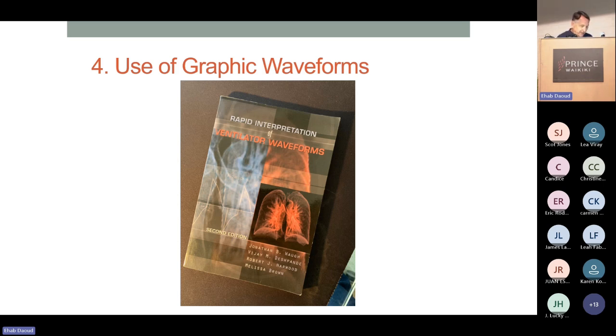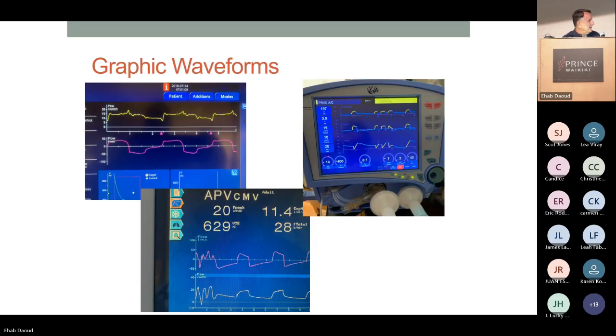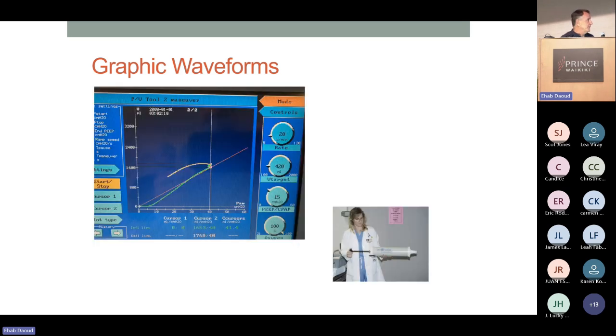So you can find a variety of things just by looking at the patient's waveforms. This is an older ventilator we have in one of our hospitals where we have a consistent problem with this kind of flow waveform that must represent some problem with the exhalation valve or the expiratory flow sensor. And being able to look at that, sometimes I've been texted pictures of this when I'm at home, and I let the therapist know that either there is or isn't a problem with the patient. We talked about this some yesterday.